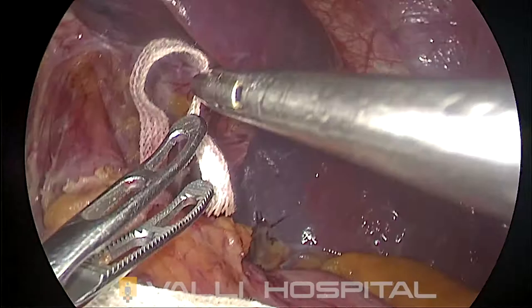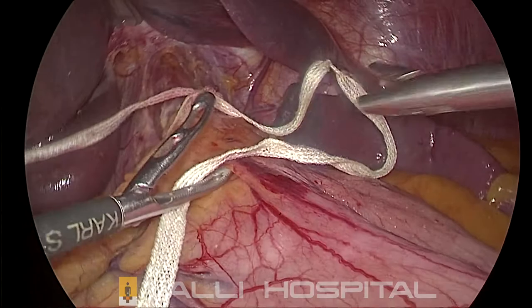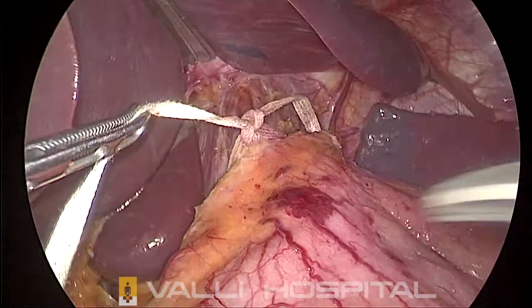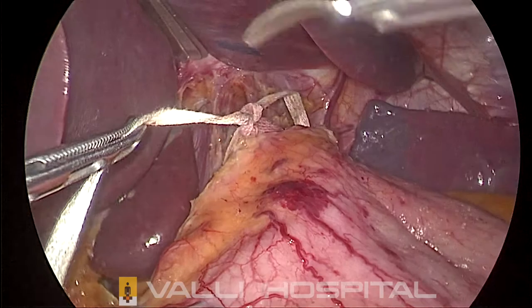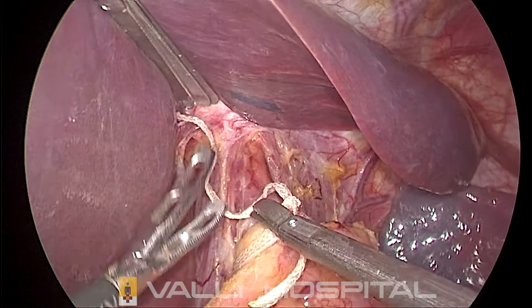Then put a surgeon's knot. Two knots are enough, but it is always better. Sometimes it will come off. So three knots ideal. Put a knot, lift and see there is a gap. Tighten it. Then cut the extra thread. Otherwise it will be dangling and it will be disturbing your suturing.